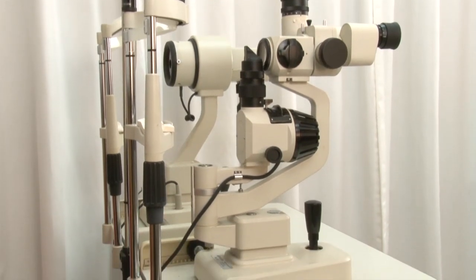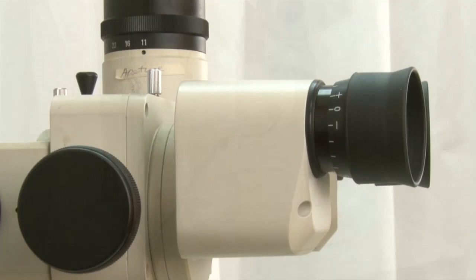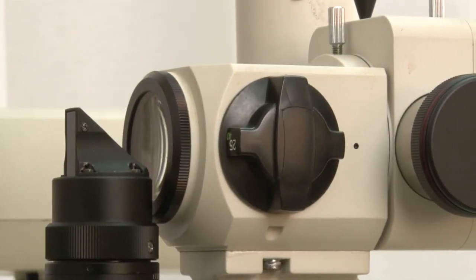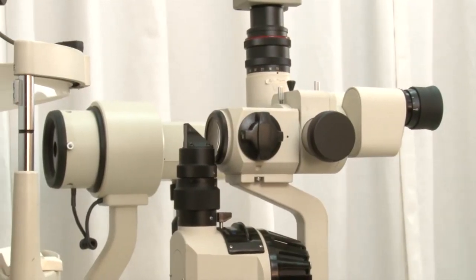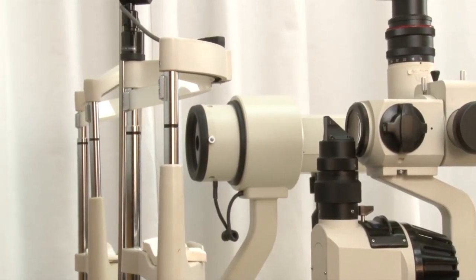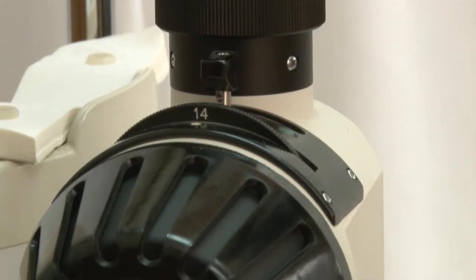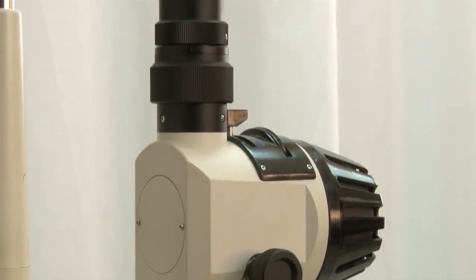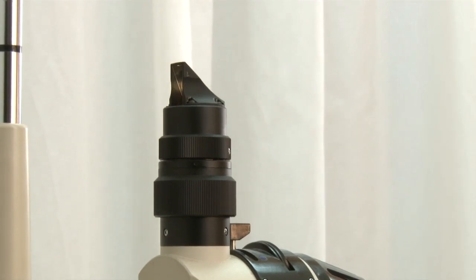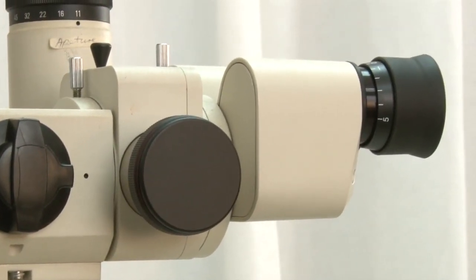Its wide magnification range, variable illumination system, and unlimited angle of view make it indispensable for viewing ocular tissues and performing diagnostic and treatment procedures, including corneal evaluation, crystalline lens observation, gonioscopy, tonometry, laser procedures, fundoscopy, and contact lens evaluation.